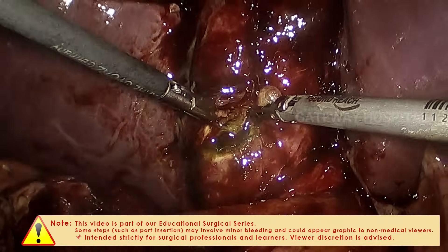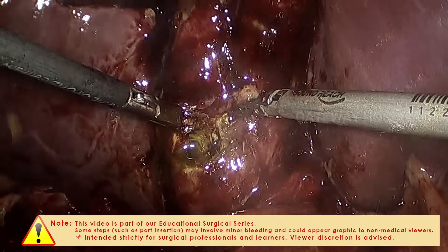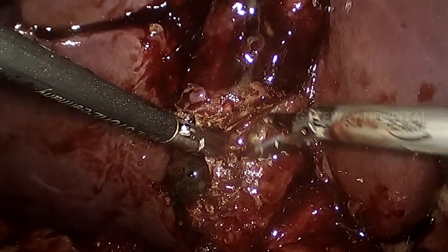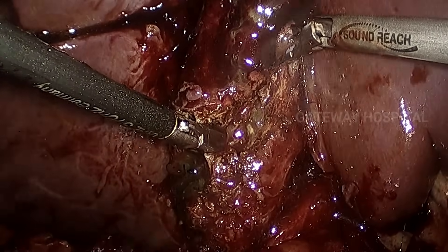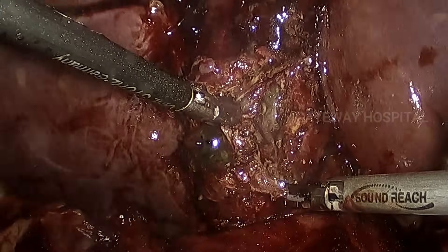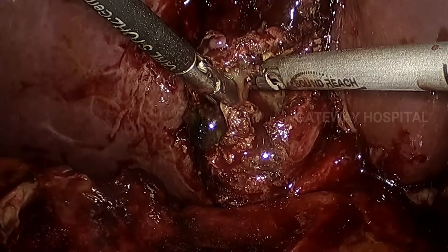In the regular retrograde technique we start dissection from the fundus, but in the modified retrograde technique the fundus retraction is kept intact and we start dividing the gallbladder in the middle at the level of the infundibulum, so that we will not be losing the fundus traction. We are retaining the advantage of cranial traction of the fundus while also gaining the advantage of the retrograde approach. Go away from the dangerous area and divide the gallbladder circumferentially — ultrasonic shears are very useful in difficult cases.